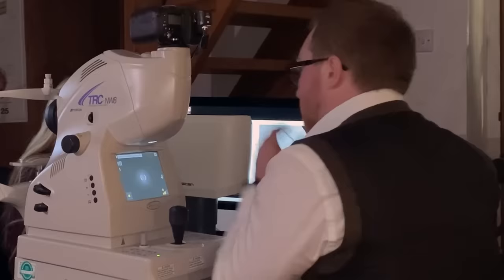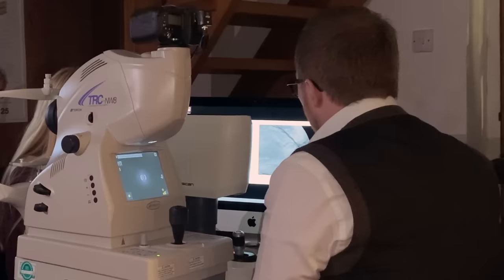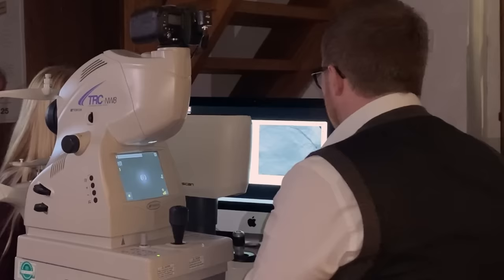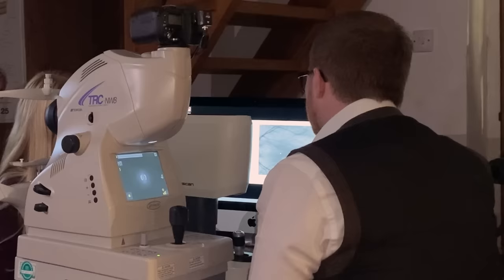This image just shows us the health of the tissue within the optic nerve. And you can see the blood vessels coming in and going out of the eye as well. And then the very centre of the retina, this area here, is called your macula, where you get your detailed central vision from. You'll have a look on the photographs, they're nice clear images and colour photographs. That's all looking very good. So all the scans came out nicely for both eyes, which is always good.